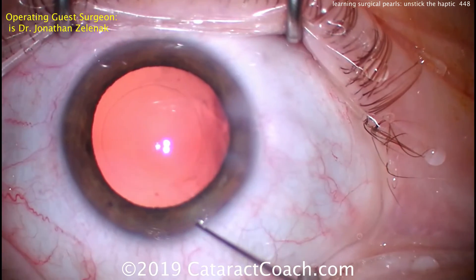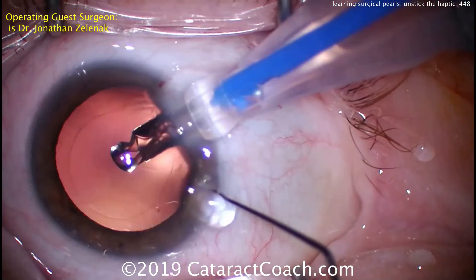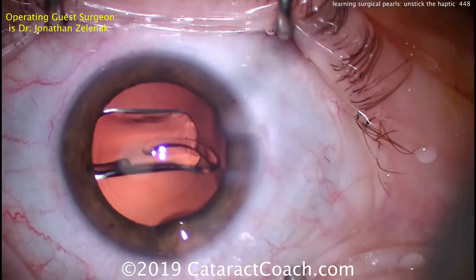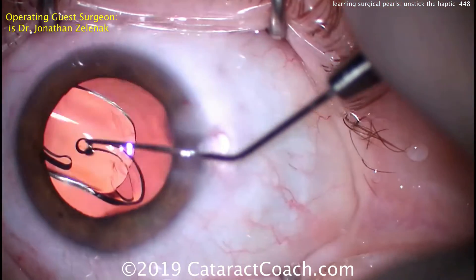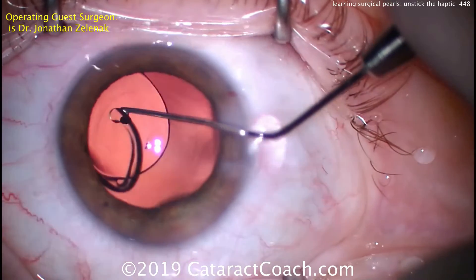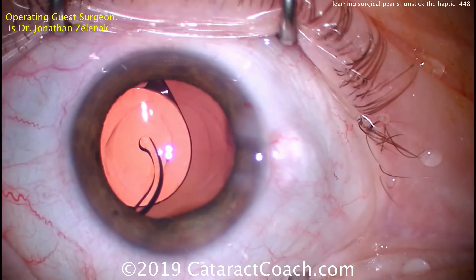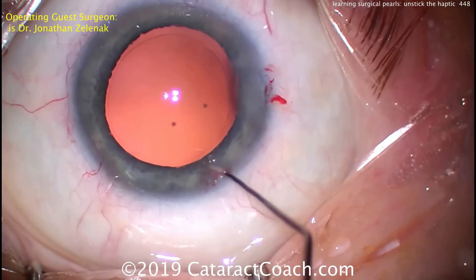Again, he's going to deliver the same type of lens — a single-piece lens. The surgeon is sitting temporally, with the video shot from superiorly. There goes the lens into the capsular bag, and then again the second instrument is used to get underneath it at that one spot and lift up towards the corneal apex, and that releases it quite nicely.